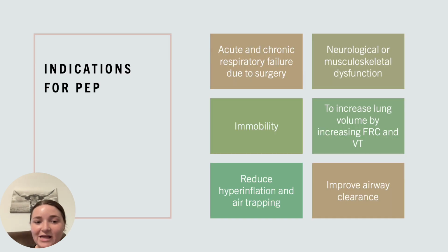So what are our indications for PEP therapy? These are going to include acute and chronic respiratory failure due to surgery, neurological and musculoskeletal dysfunction, immobility, to increase lung volume by increasing FRC and VT, reduce hyperinflation and air trapping, and improve airway clearance.